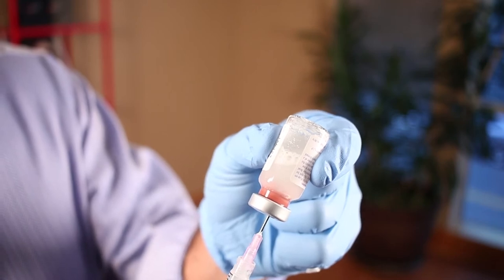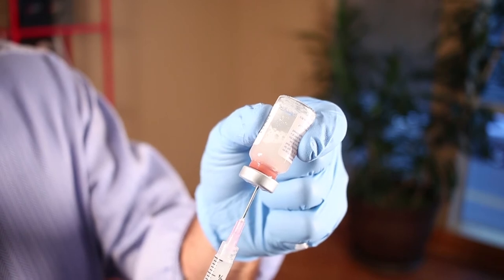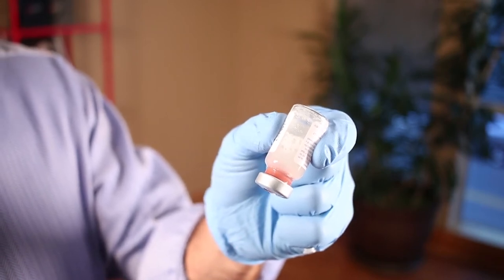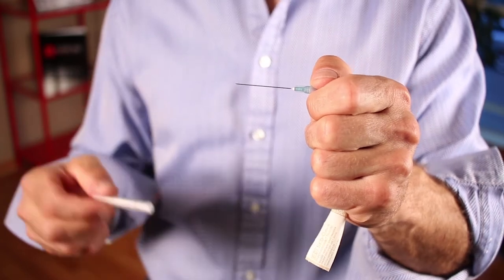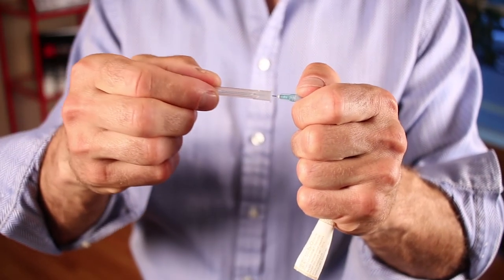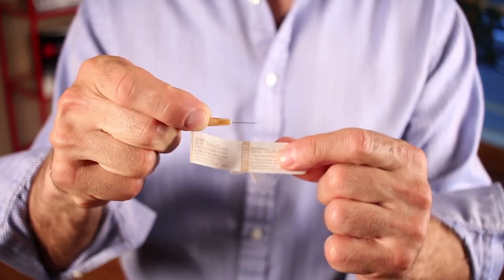When we use the 18 gauge needle to extract the product, we go from the middle of the fluid — this avoids the clogging carboxymethylcellulose. Then we use a 25 gauge one-and-a-half inch needle, or most commonly a short 26 gauge needle, to inject.